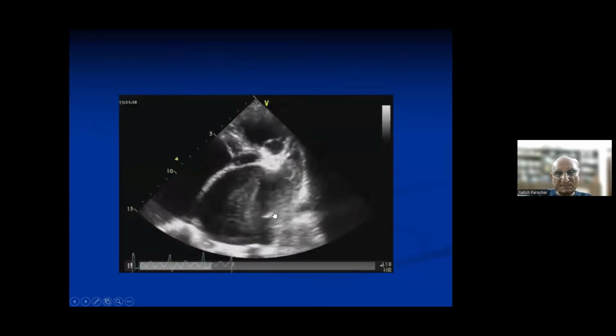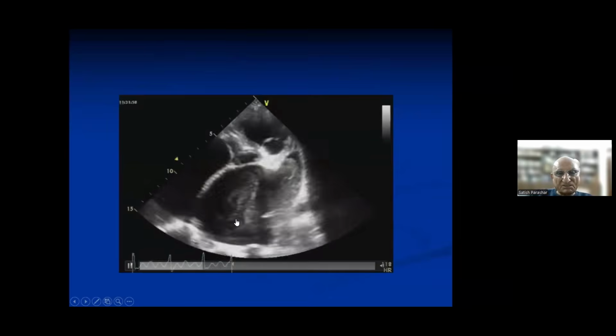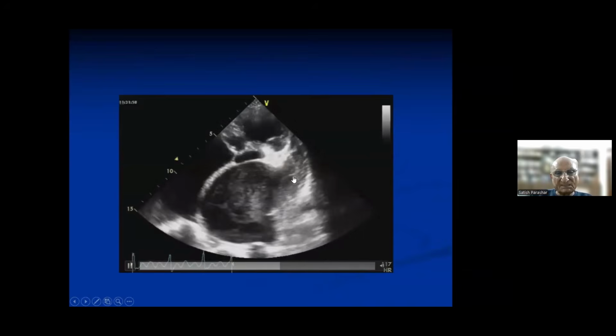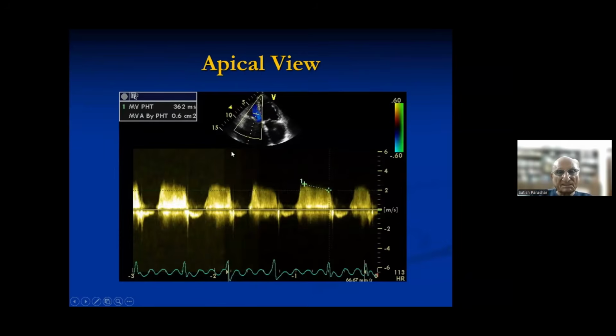And here you can see a large thrombus in the left atrial appendage, and you can see a spontaneous contrast echo. So never ignore any 2D findings, and they always give you some information. You see again, this is the LA appendage and the clot going into it, and you see spontaneous contrast echo. And then you take a mitral valve area, it's about 0.6 centimeters squared. So it will be variable. So that is how you take an apical view.